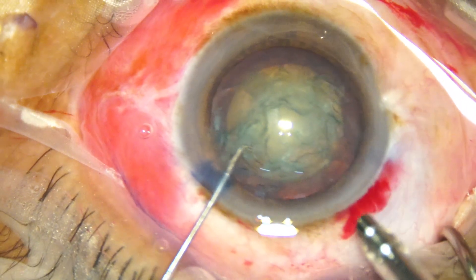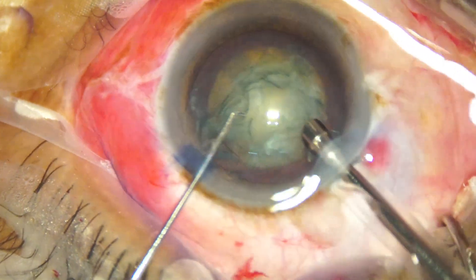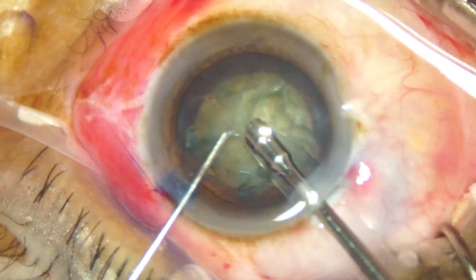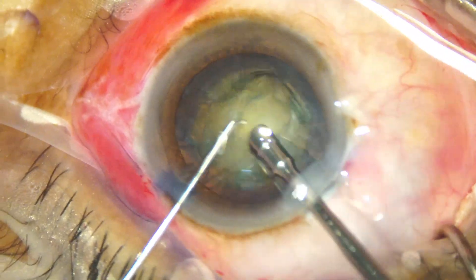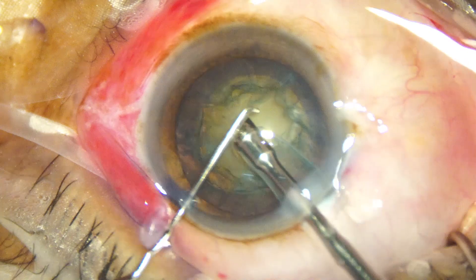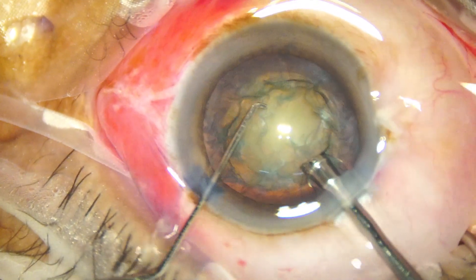The initial steps have been done and now she goes in and removes some superficial cortical lens matter for better visibility. The cataract is grade 3, or maybe between grade 2 and grade 3, and now she is trying to do direct chop.